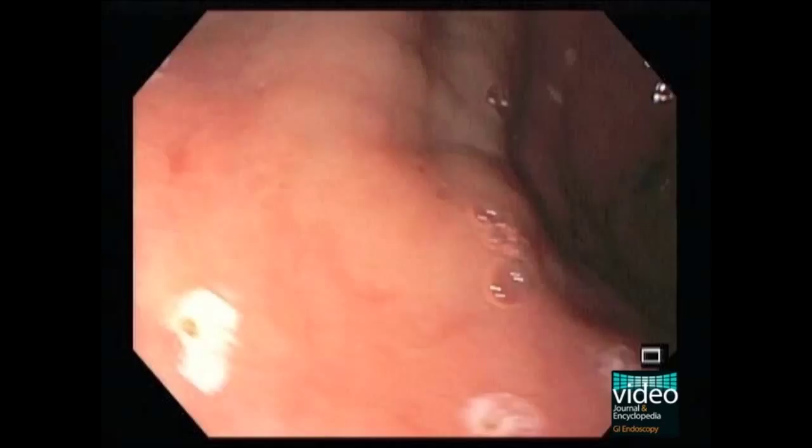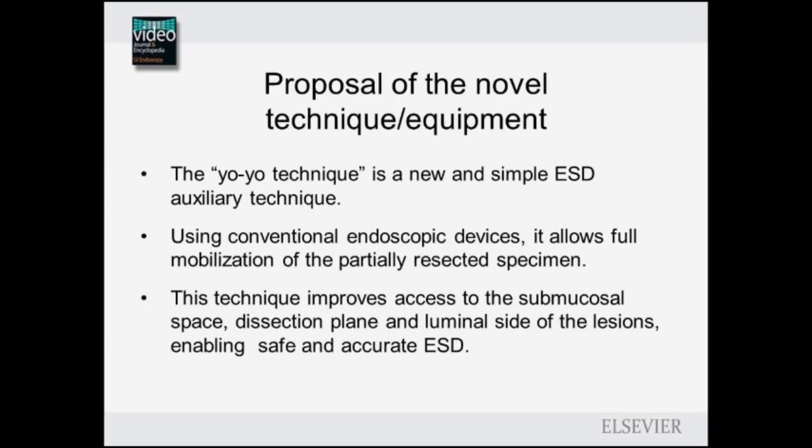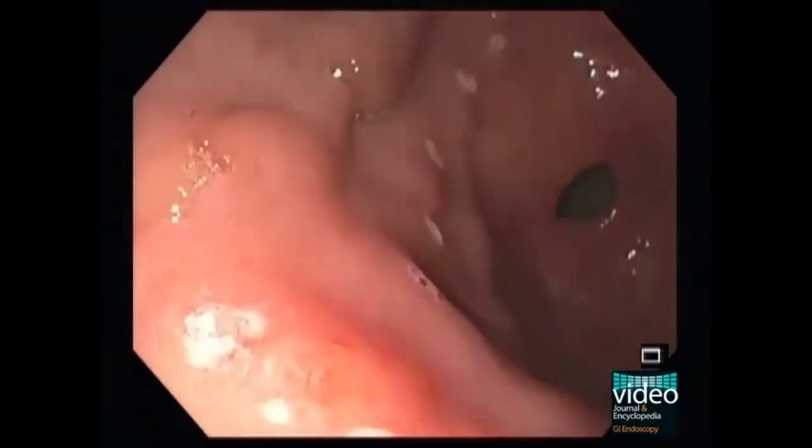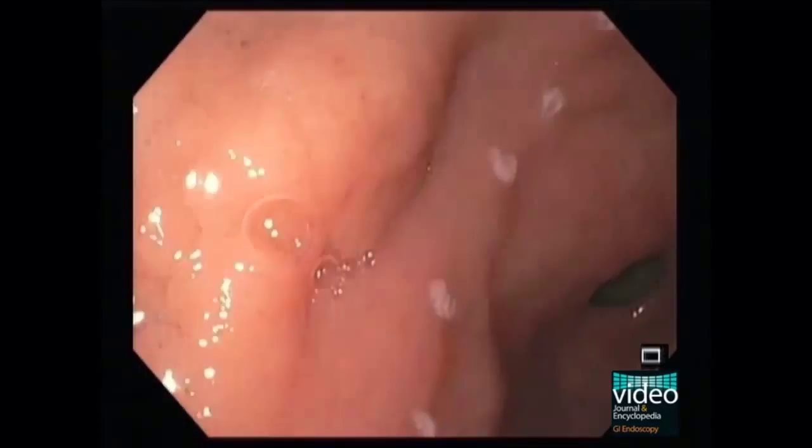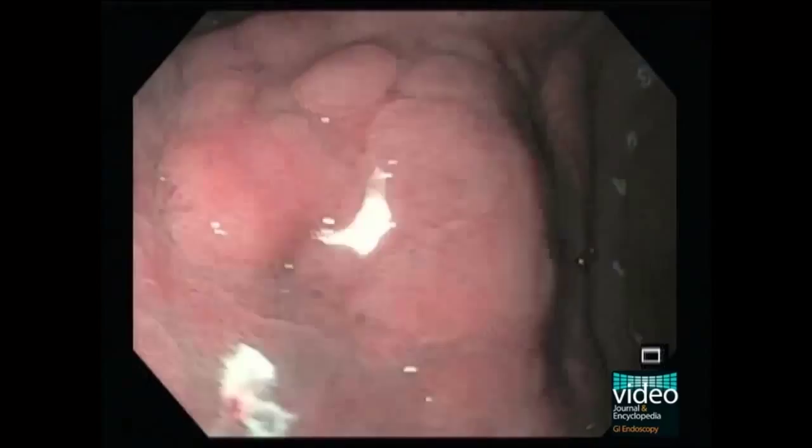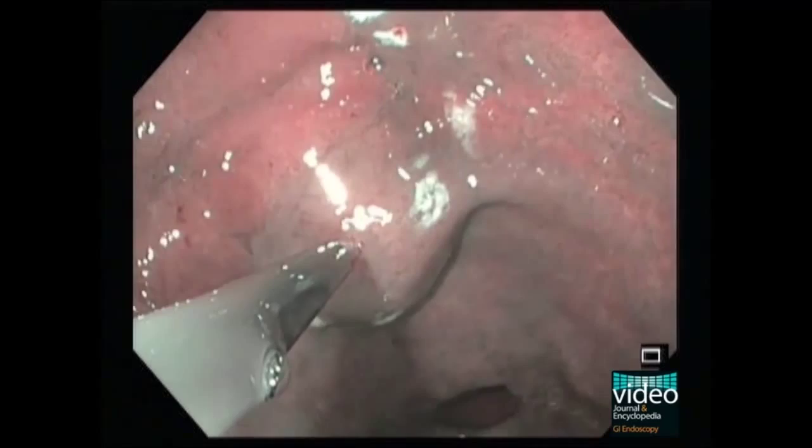For demonstration of the technique, a case of a patient with a type 2a dysplastic gastric lesion referred for ESD is presented. For lifting, a solution of saline with adrenaline, hydroxypropyl methyl cellulose, and methylene blue is used.